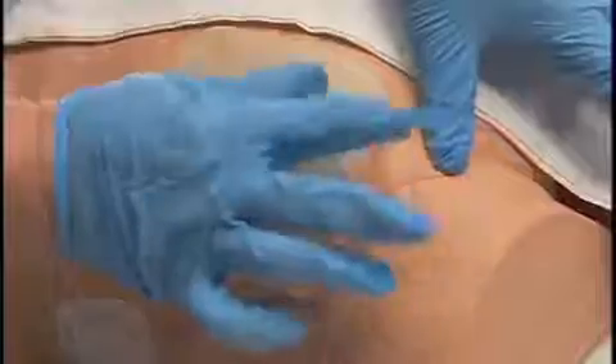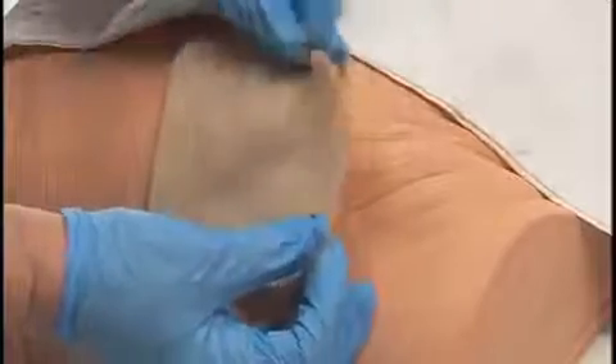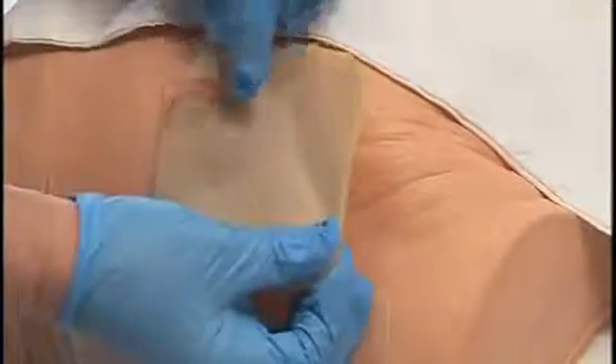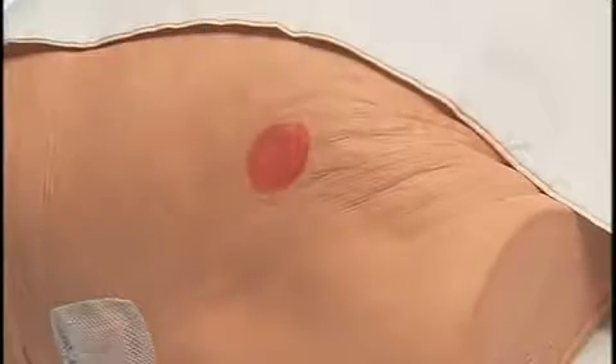To remove a hydrocolloid, press down on the skin and carefully lift an edge of the dressing. Continue lifting around the dressing until all adhesive edges are free, then gently peel away from the skin in the direction of hair growth. An odor may be noted upon removal; the odor should disappear once the wound is clean.